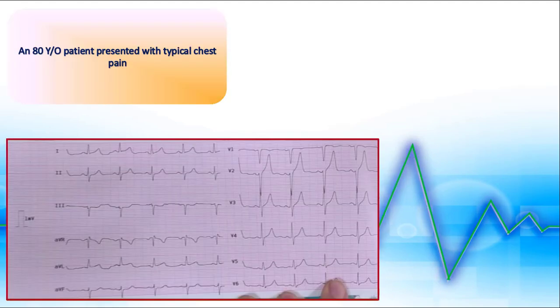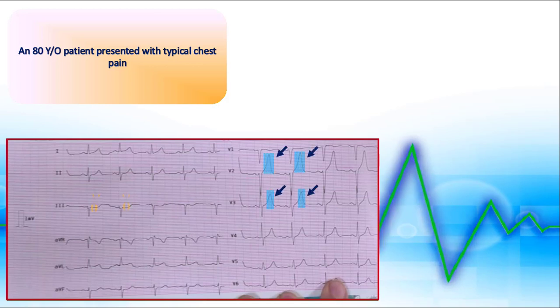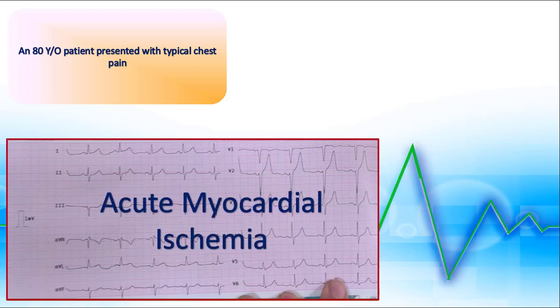The next strip belongs to an 80-year-old patient presented with typical chest pain. There are symmetrical tall T waves in V2 and V3 with ST depressions in D3, which suggests acute ischemia.